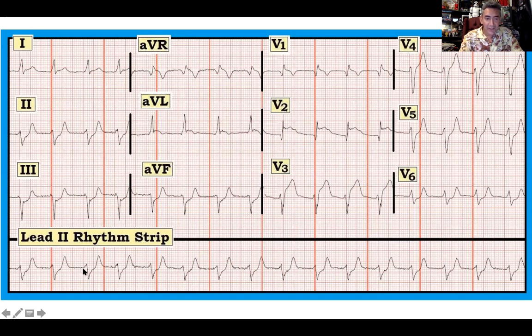So again, we can see a little bit of what's going on. It's not as pretty as the book and the notes, with very clear, defined waves. This is an actual ECG. Again, we can make sense of our R spike. And we've got some stuff going on: a little P, very deep Q, R, S, kind of hard to see a T. So there's a couple of things going on here in this patient.